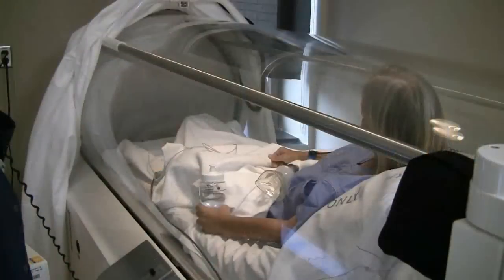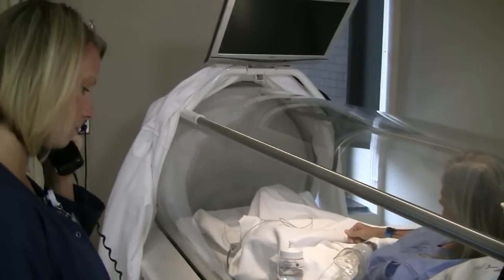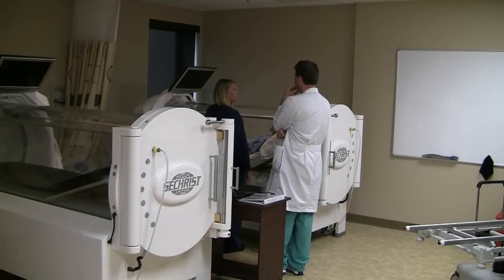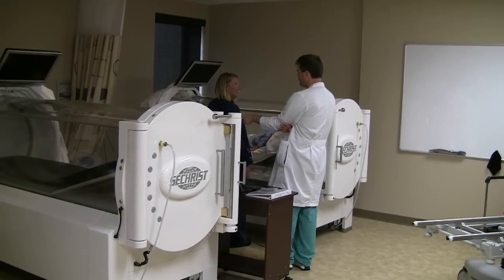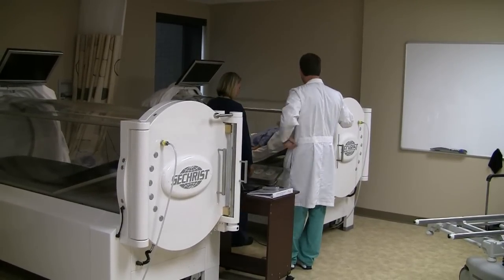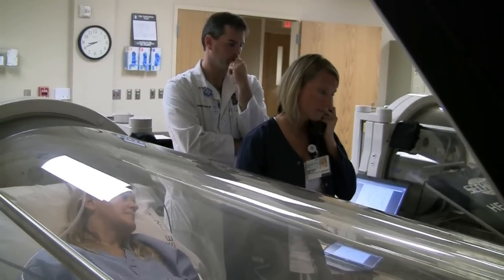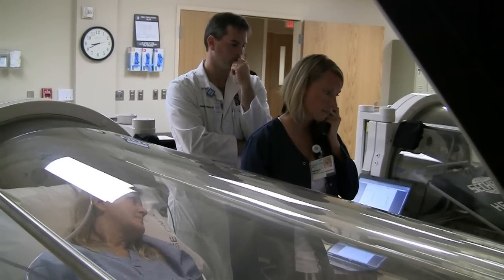The hospital has been extremely supportive of everything we've put forth in this effort, including our efforts for hyperbaric oxygen. We do have two hyperbaric oxygen chambers installed and ready to treat. We have an area plumbed for two additional chambers, so we have access to four.